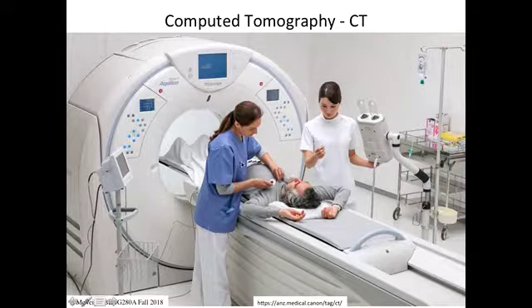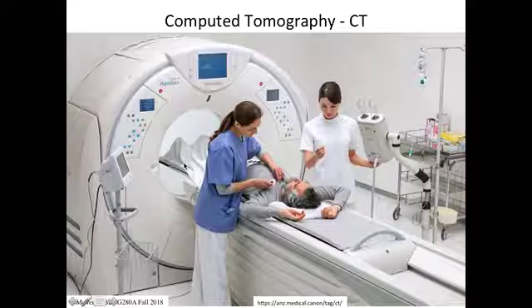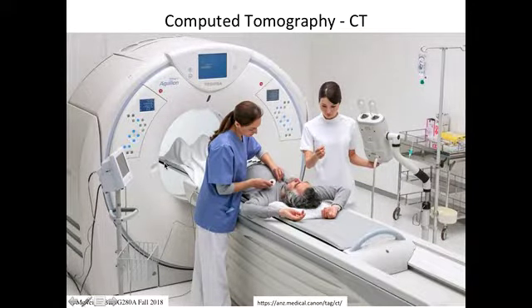This patient on the patient table is having ECG leads applied to the chest so that with this monitor you can watch their heart rate and look at their EKG. The table upon which the patient is lying is essentially X-ray translucent. It doesn't stop many X-rays. You can see it in images, but it doesn't attenuate many X-rays, so you can just shoot X-rays right through the patient.